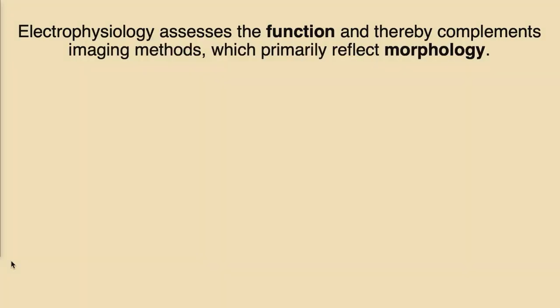Electrophysiology assesses the function and thereby complements imaging methods, which primarily reflect morphology. That's a very important point if one wants to understand the purpose, or the value, of electrophysiology.